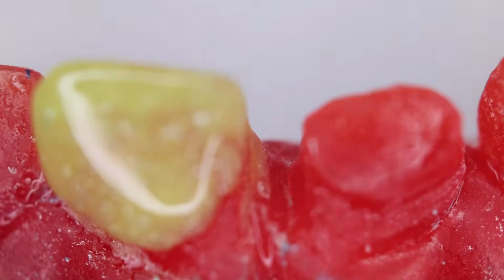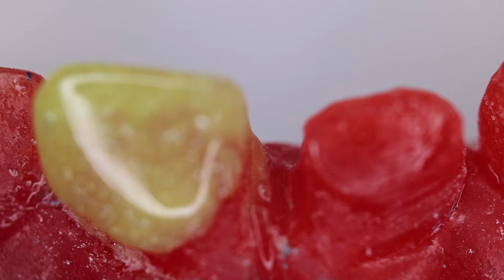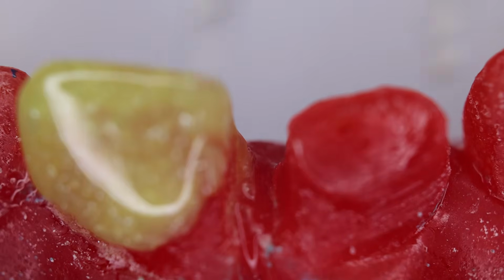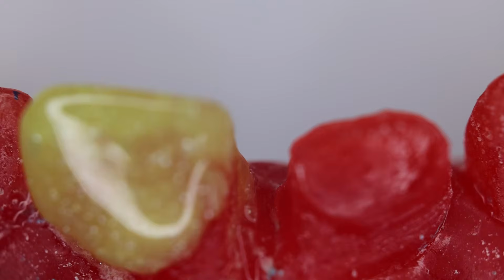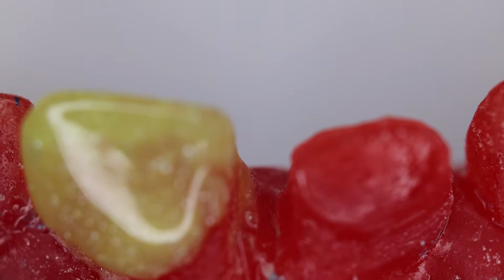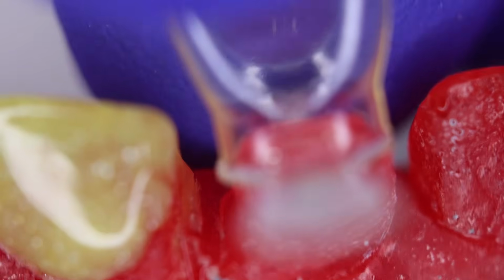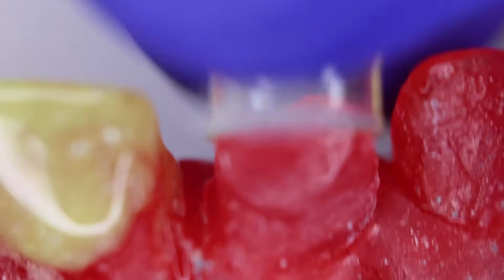So when we are planning this crown, we are selecting on the basis of the mesodistal width, which is roughly around 7.4 mm for this crown. So we would select the same. When we select the crown based on the mesodistal width, this is the crown that we get, and for this crown to go inside we need to remove or cut the segment at the neck.